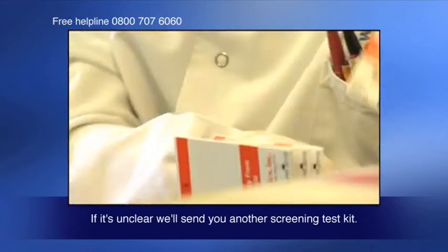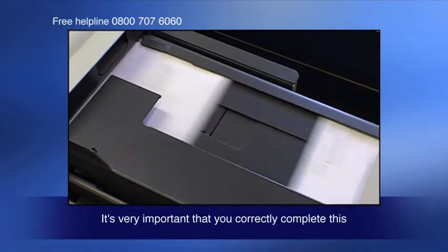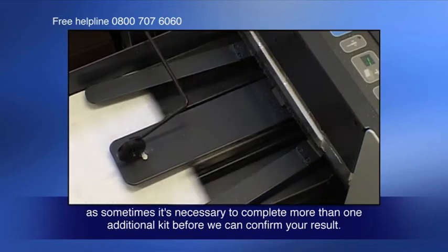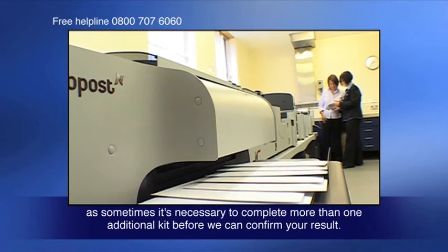If it's unclear, we'll send you another screening test kit. It's very important that you correctly complete this, as sometimes it's necessary to complete more than one additional kit before we can confirm your result.